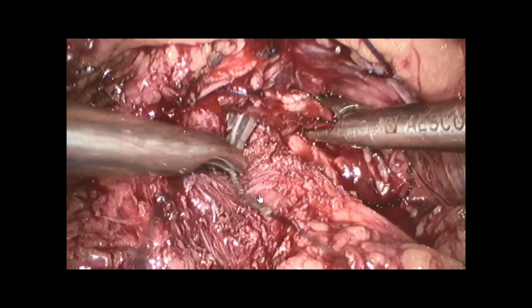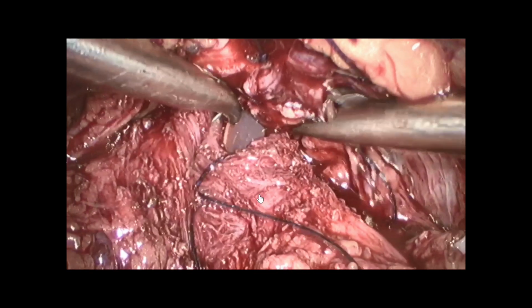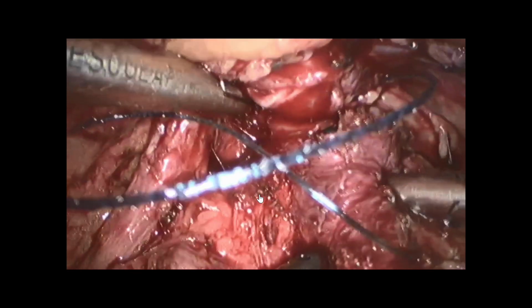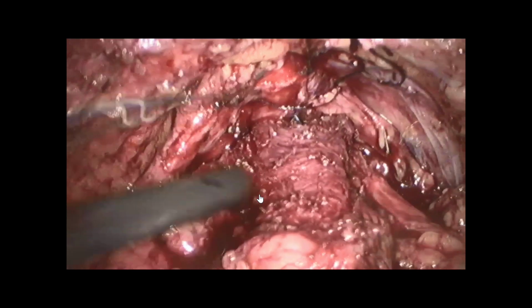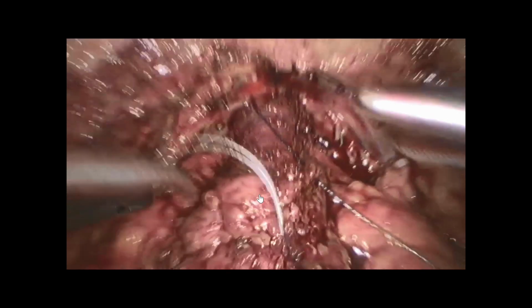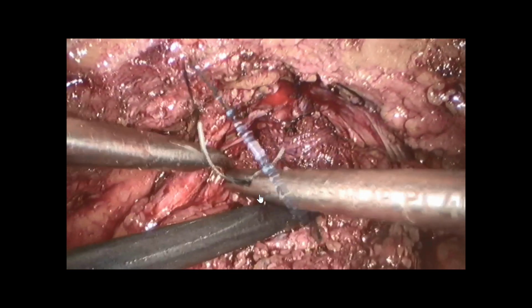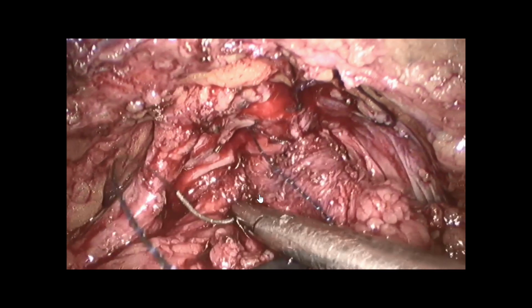So that means that this part will be totally fixed. So you see, after I will refix the bladder to this part anteriorly. And again, you see the bladder neck will be fixed.